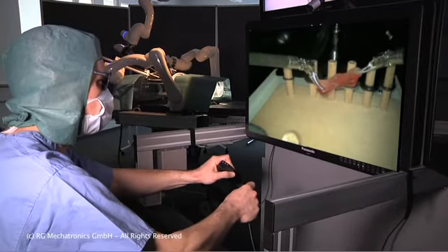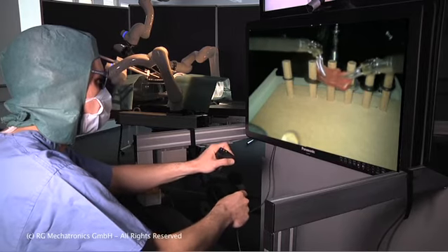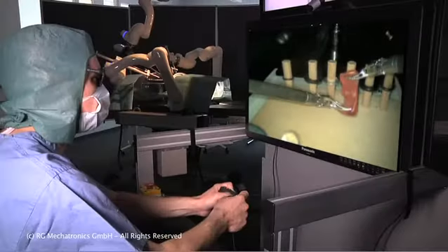The input device is equipped with a force sensor, which allows the surgeon to vary the strength of his grip from either very lightly or to a very strong grip, as demonstrated here.